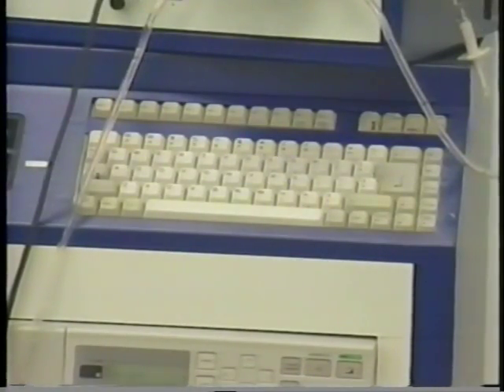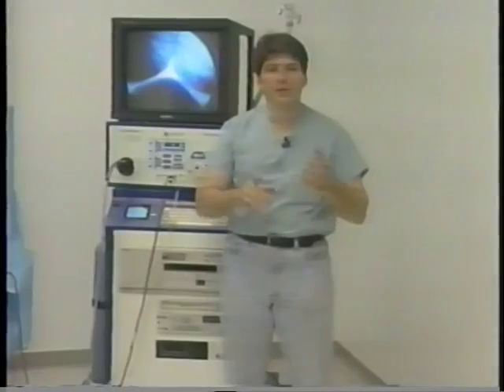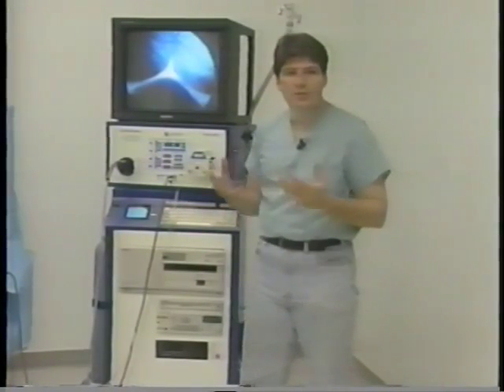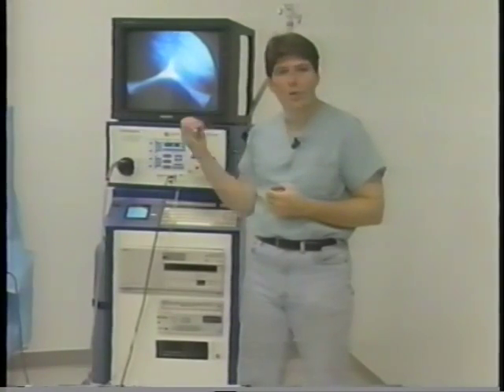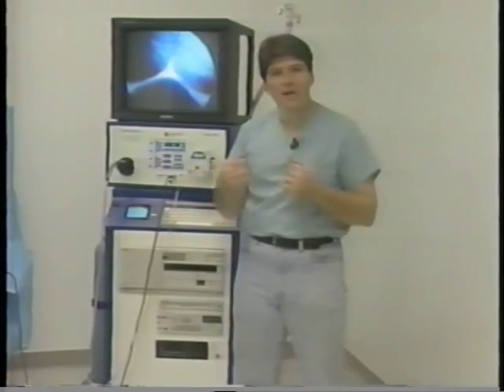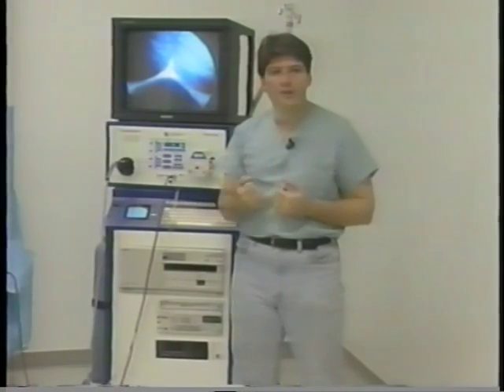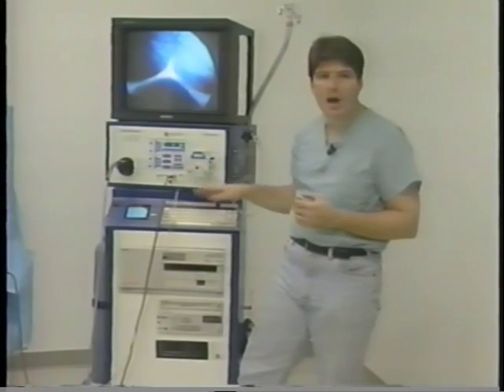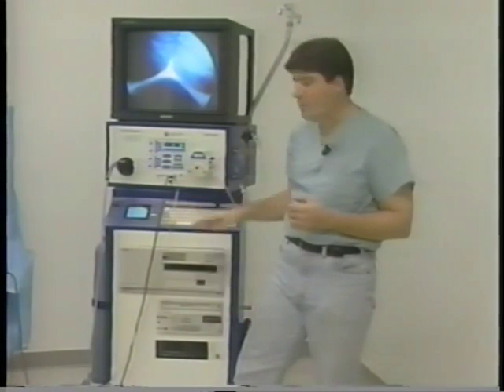The system also contains a character generator. This is an option; however, it's desired by a lot of physicians because it provides patient information. You can type in your name, your hospital, institution — whatever. It will show up on the screen every time you start the system up, and you can specialize it for each patient's file. So when you're videotaping, it remembers that information. That keyboard and computer is an option available right now.